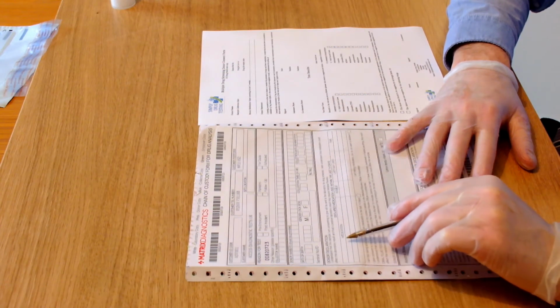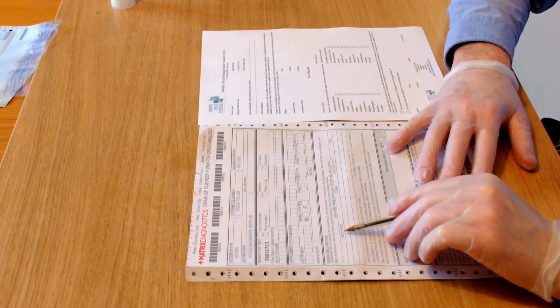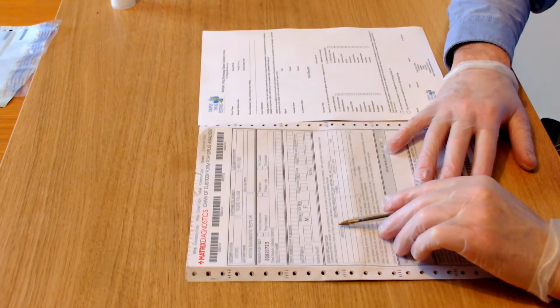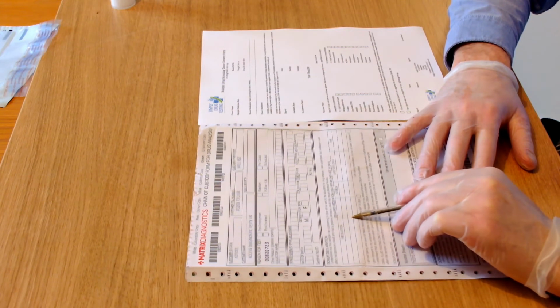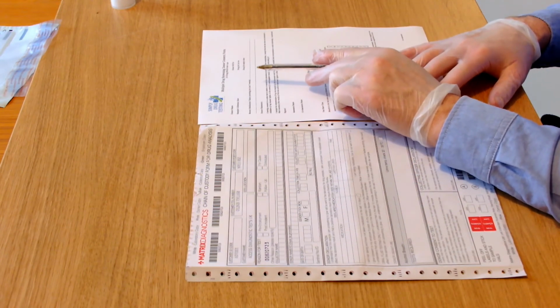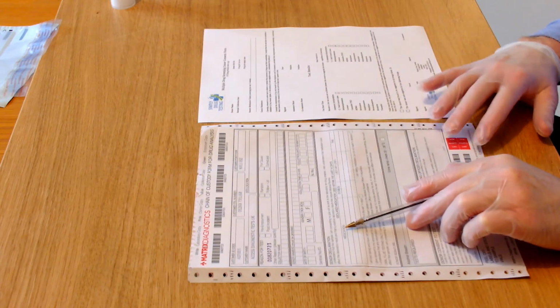Underneath that is a donor declaration which is asking about medication. It says, I understand that the sample I am consenting to give will be sent to the laboratory for drug analysis. I also understand that medication could affect the laboratory result and that a positive laboratory result may require medical review. So we list medication they've taken there, and if we've already filled out the initial donor consent form for the instant test, that information will already be on the form and we just transfer it over to there.